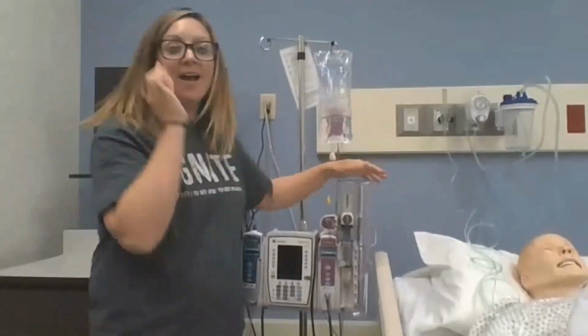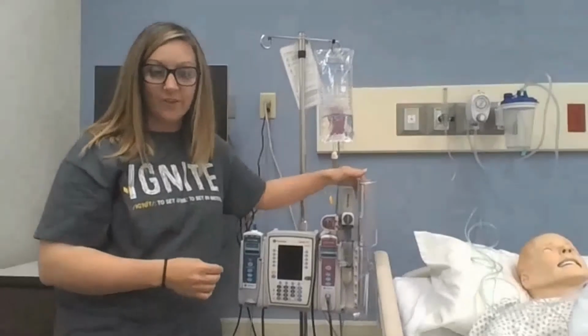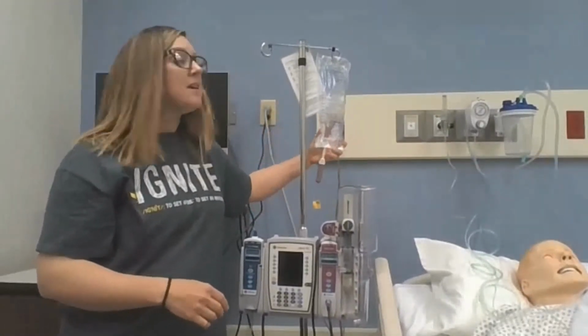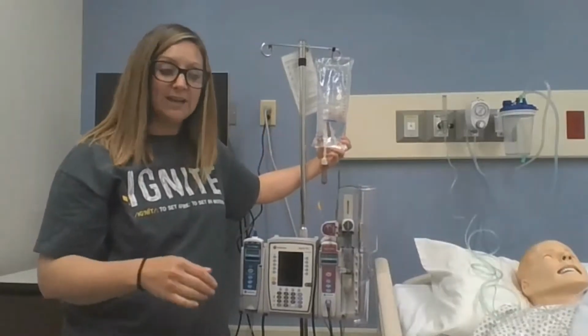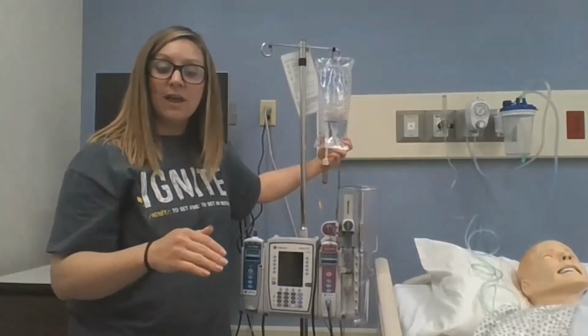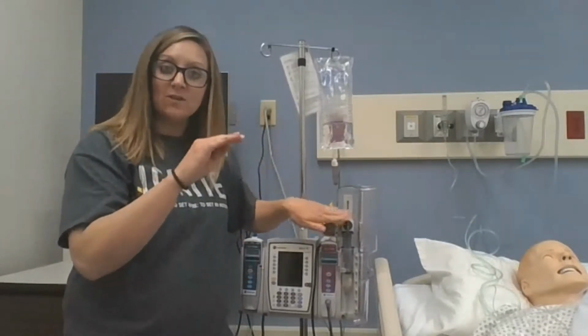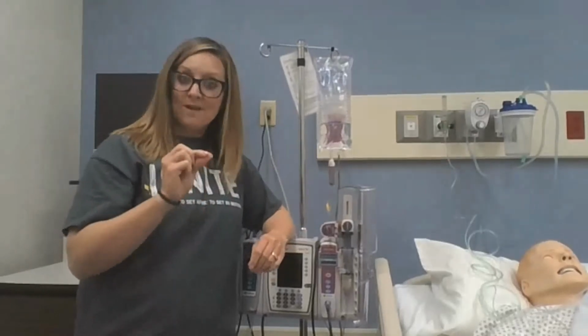You have to have primary fluids infusing for your PCA to work effectively. They don't have to be infusing fast. They don't have to be getting a lot of fluid, but you have to have primary solution to administer the PCA, because when the PCA pump pushes down on that plunger, it's literally giving little tiny drops of the morphine or Dilaudid.